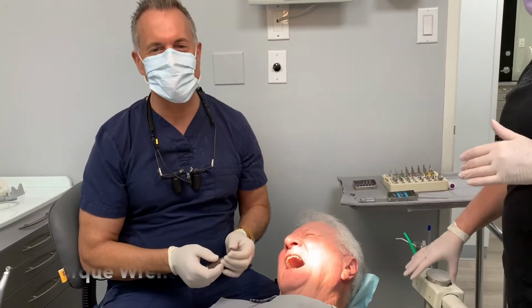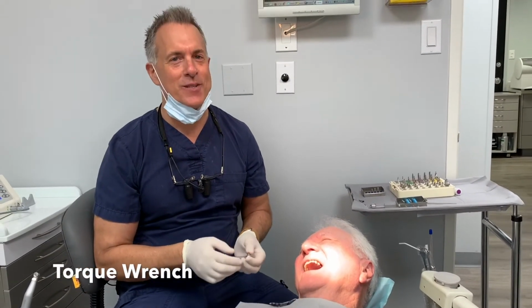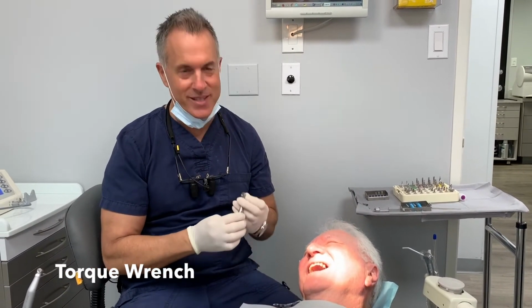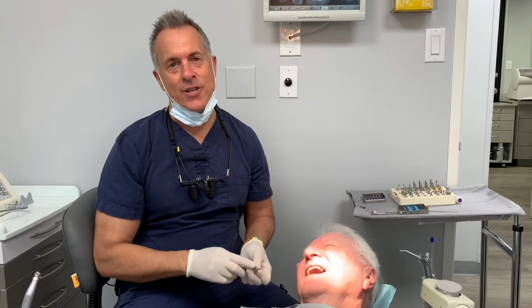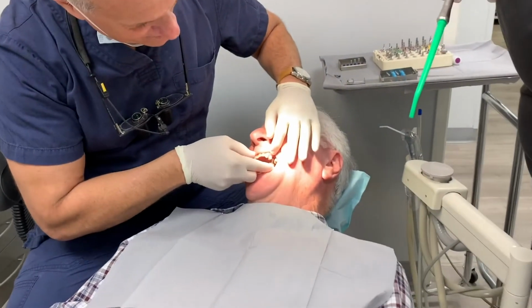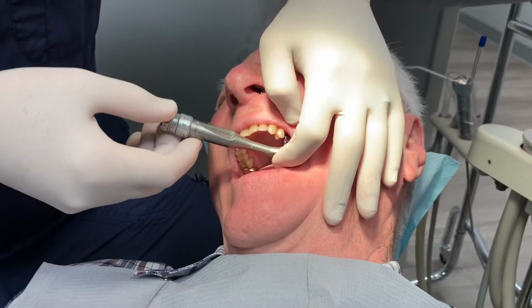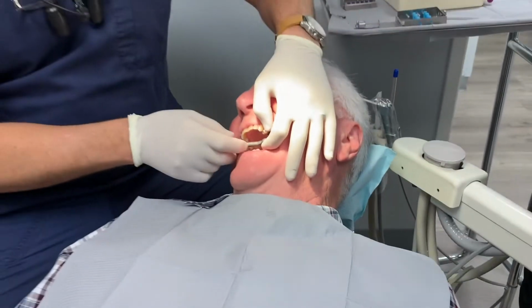Okay, so per Dr. Nisnik's request, we've decided to just torque this baby in. So I thought that we have too much torque, but Dr. Nisnik apparently doesn't think so. So just to humor him, we're going to use the Implant Direct multi-torque wrench. I have this set at 60 Newton centimeters, so we know that if it rotates, then we have less than 60. So let's try it. All right. So this is 60. And I'm greater than 60. So what do I do, Doc? You're done. Put the healing collar on.